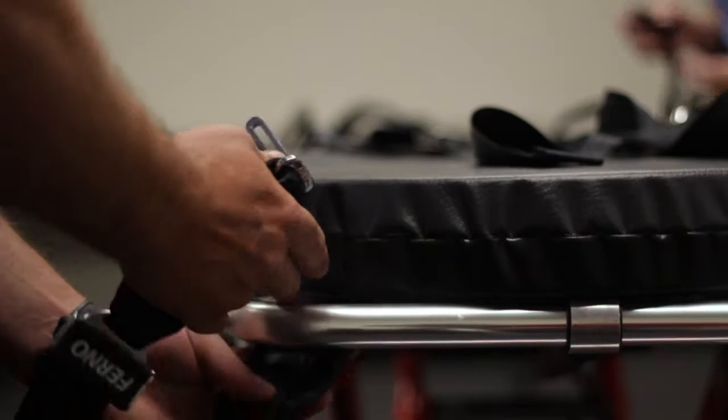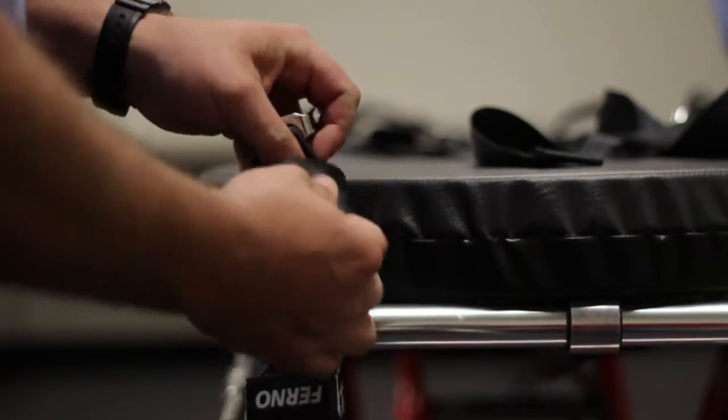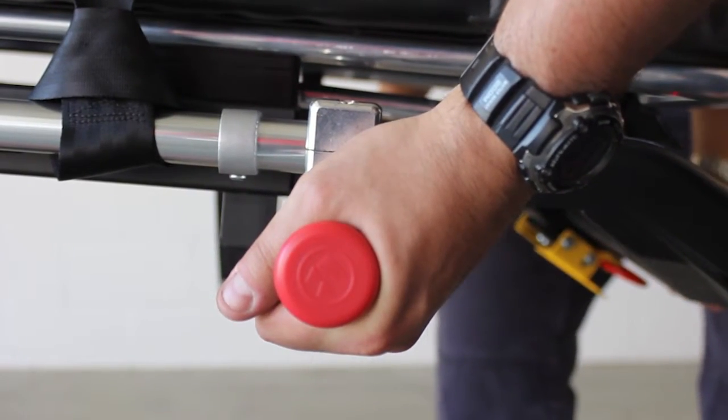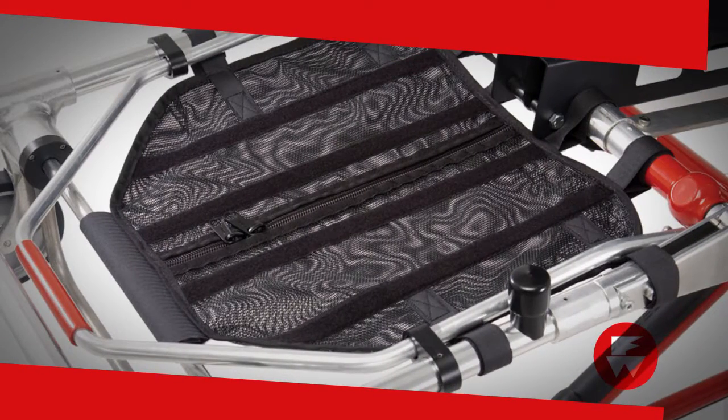Attach the restraints and any accessories that were ordered for the cot. Some of the more popular additions are the telescoping side handles, which are useful when using extra people to lift heavy patients, an IV pole, and the soft net for drop frame storage.